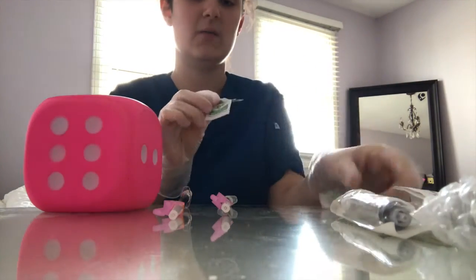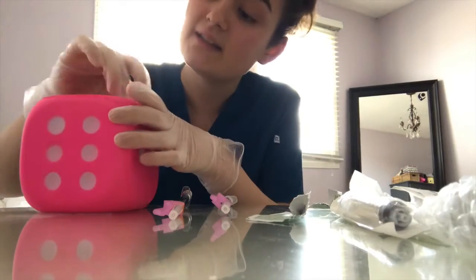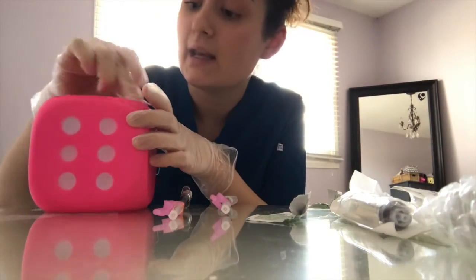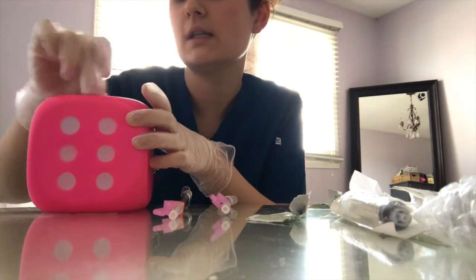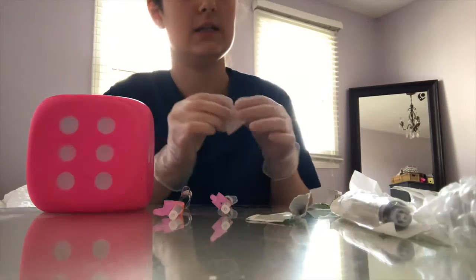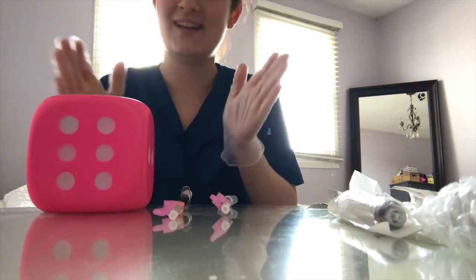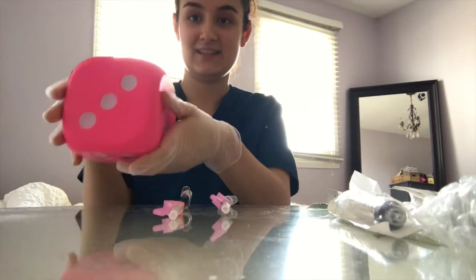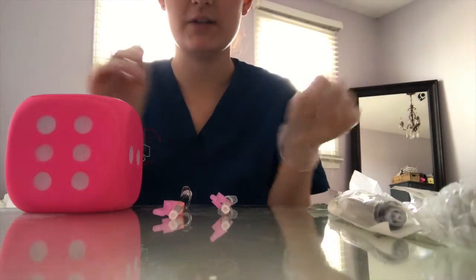Alcohol wipe. Why are we doing this? Because we're cleaning the skin. And why are we cleaning the skin? Because we want to remove the normal flora of the skin before we inject, because if we don't, then we introduce displacement of the normal flora into the vascular system, and that can cause infection. So, I've cleaned it, okay? I've cleaned the dice. It's clean, and I'm going to let it dry. It's dry now, so what do we do?